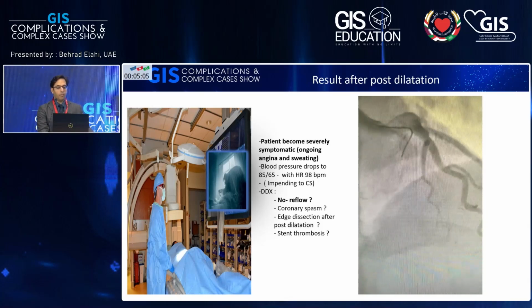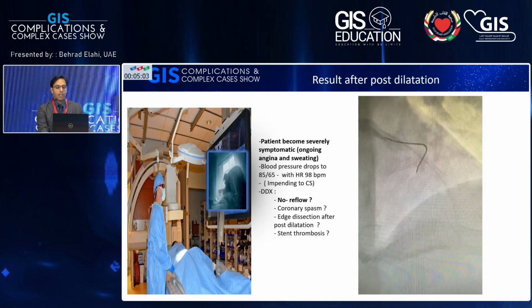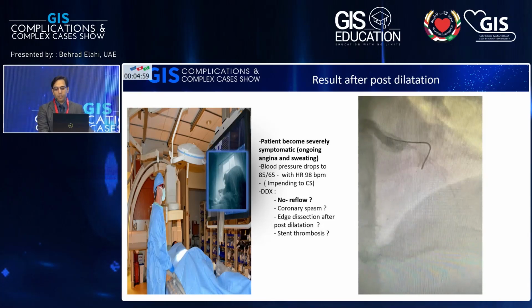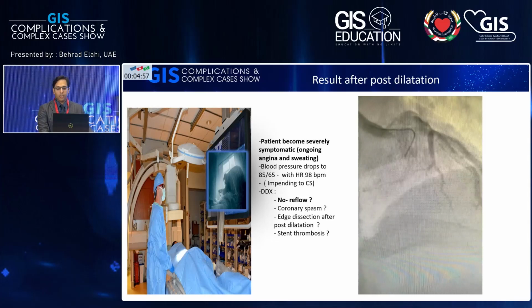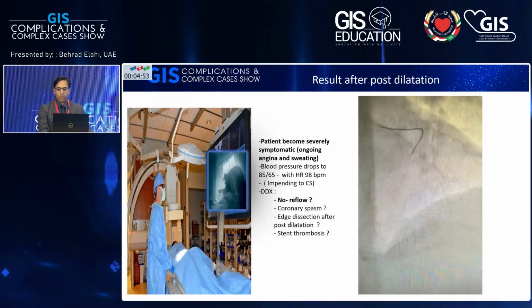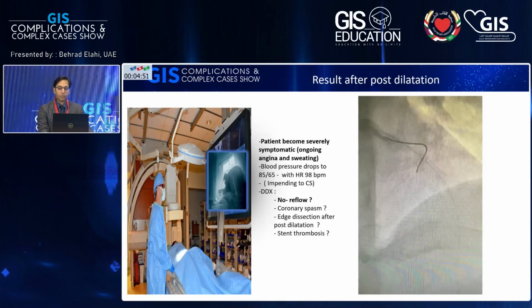And when I see the monitor, as you see on the left side, I see the angel of death is coming to take the patient, and we should act very quickly in these situations. There are different options here. We should go for mechanical support, or we start to try the treatment of no-reflow.